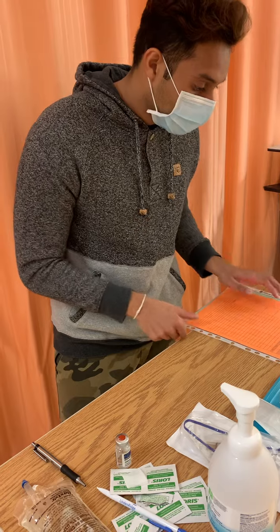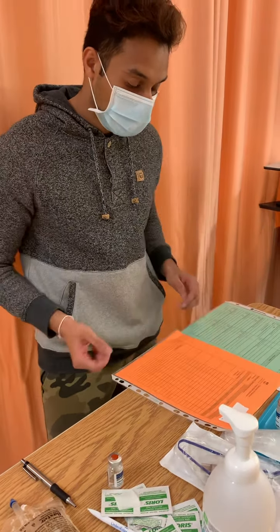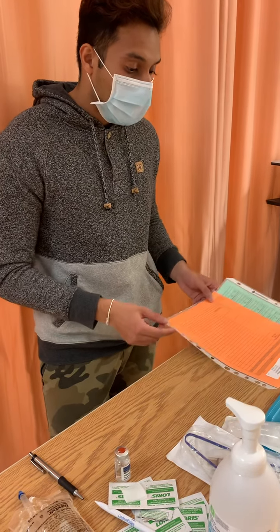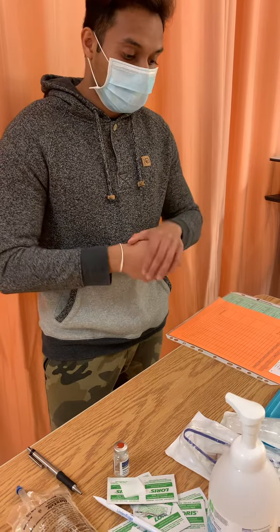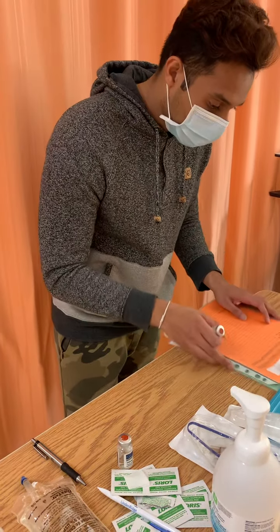It's Watson William. We see that his date of birth is June 14, 1983, and we see that we transcribed the prescription order and the MAR. It's probably been transcribed, and we've grabbed our medication out of the PYXIS system machine. So we're just going to do our first check. We're going to wash our hands before we touch our med. So, doing our first check here.